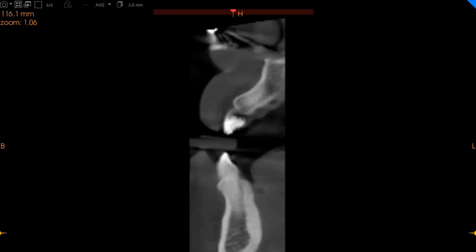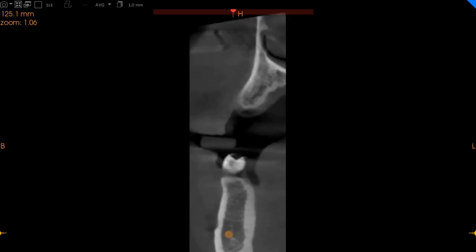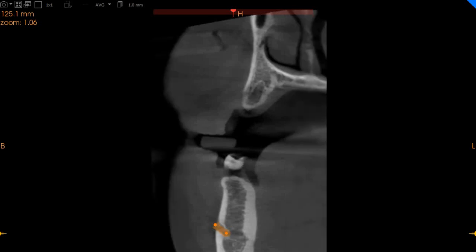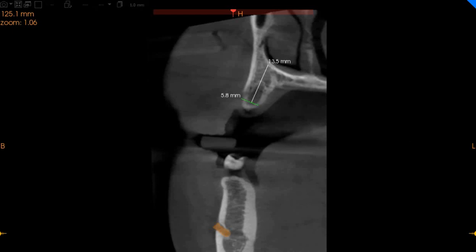Moving to the upper left region, which is the first premolar region. Here you can very clearly see that we've got a slightly thinner ridge in this region. We've got approximately 5.8 millimeters of width and thirteen millimeters of height.